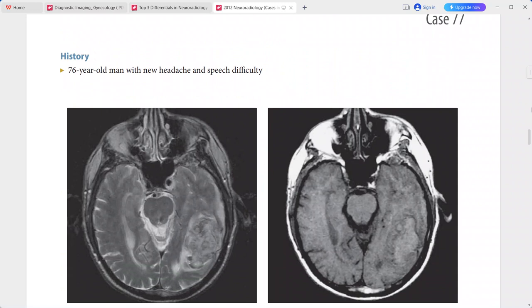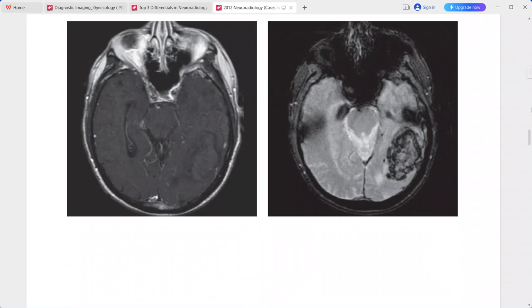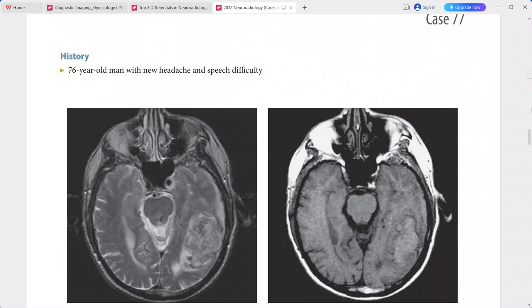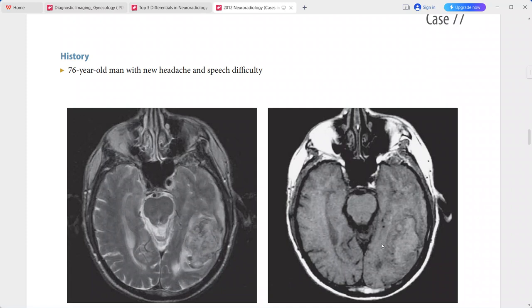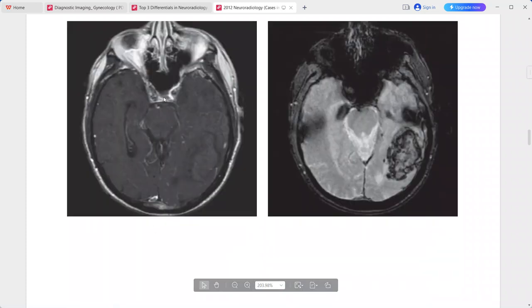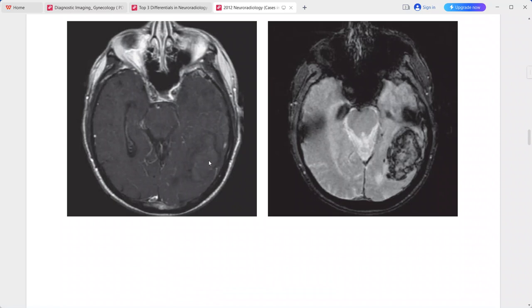Next is a 76-year-old patient presenting with new headache and speech difficulty. There is a lesion in the left posterior temporal lobe with moderate mass effect. The lesion is isointense on T1, hyperintense on T2, and shows no enhancement on post-contrast sequence.